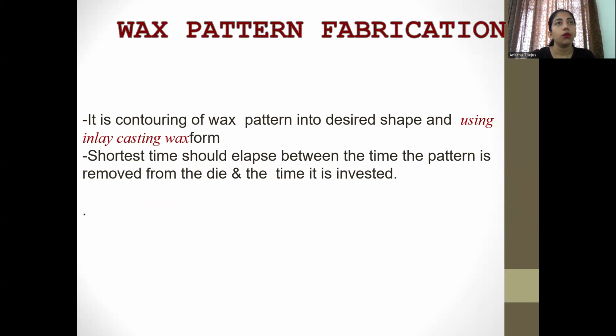Next, we have wax pattern fabrication. We'll discuss the fabrication of wax pattern. Wax pattern fabrication is nothing but the contouring of the wax pattern into the desired shape using inlay casting wax. The shortest time should elapse between the time the pattern is removed from the die and the time it is invested.